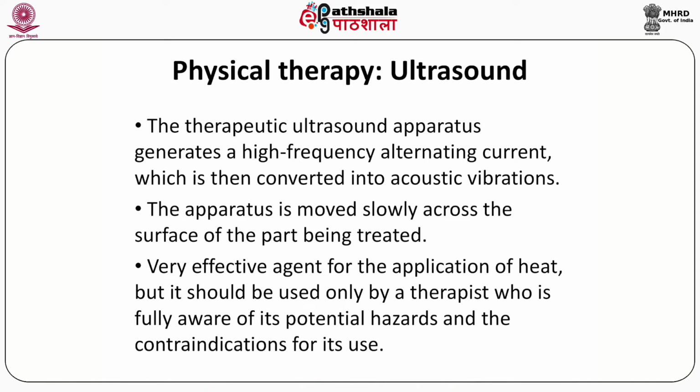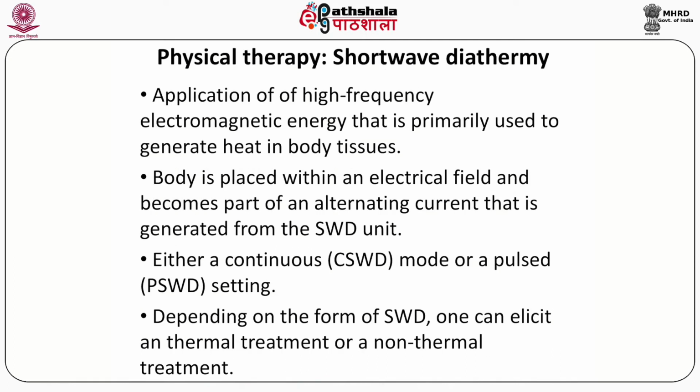And this ultrasound technique is a very effective agent for the application of heat, but it should be used only by a skilled therapist who is fully aware of its potential hazards and the contraindications for its use. Coming to the second technique of physical therapy, that is shortwave diathermy.